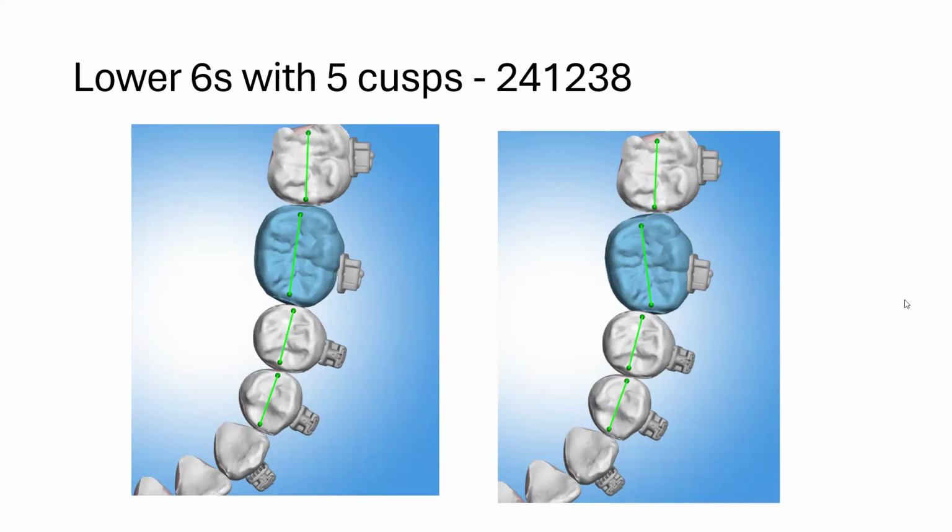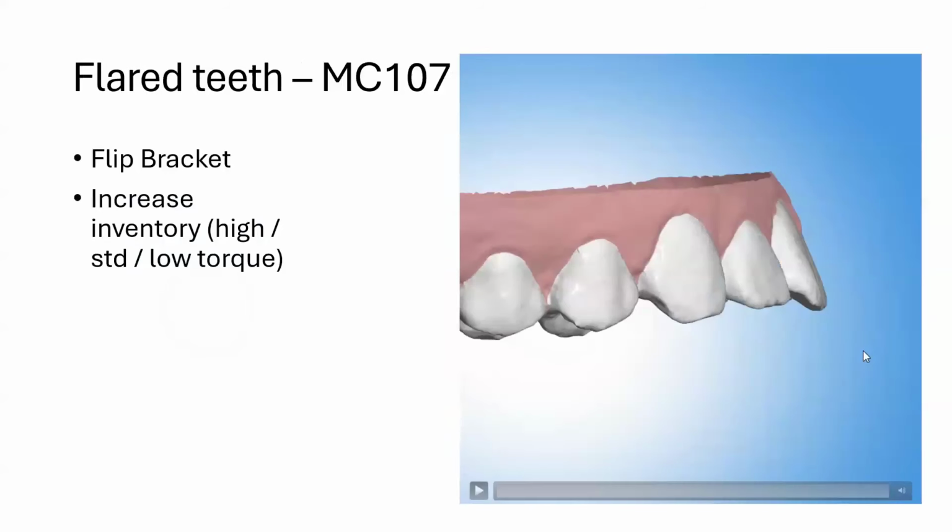Does that answer the question? Yep, I love it. Thank you, Brandon. Cool. Yeah, and then this next slide just kind of shows the flared teeth. Brandon, we have some other questions, but I think you're going to go over some clinical things in a minute, right? Yeah, I'm going to pick up the speed a little bit so we don't run out of time. Okay, I'll wait for the clinical questions when we're there.